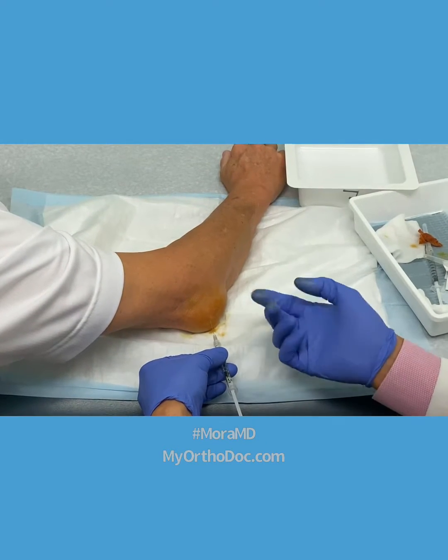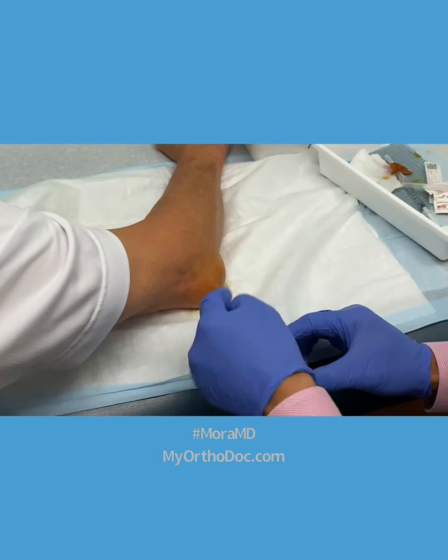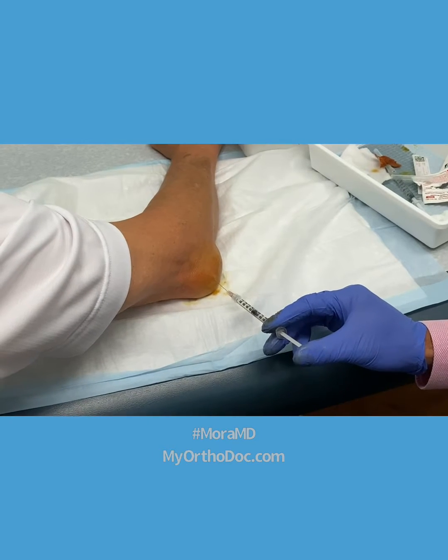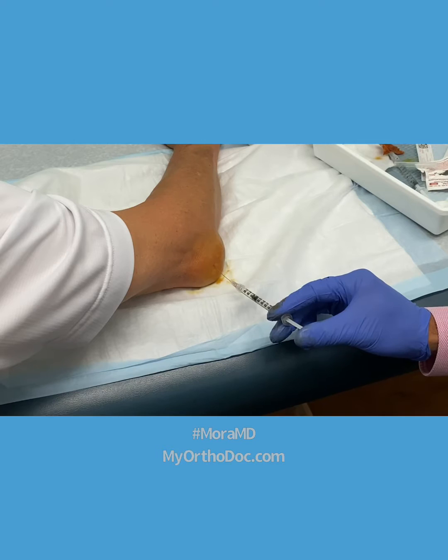There's nothing under here — there's no blood vessels, there's no nerves over here. And I can already tell there's blood because I just double checked. So I'm going to back up my needle a teeny bit, just until I get it right on the skin.